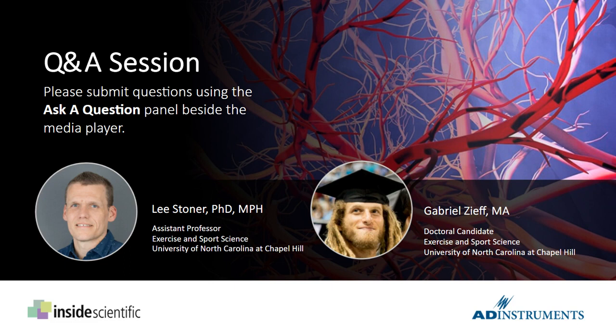This question is, which position could be the ideal position to measure pulse wave velocity in pregnant women? Yeah, that one's a trickier one. And we are doing pregnancy studies at the moment. And part of this is going to be dependent on the device that you use, because ideally you'd have them laying on their side. Because, if you think about pregnancy and all that weight around their stomach, it's going to push down on the aorta, not to mention collapse the vein. But that's going to influence your measurement.